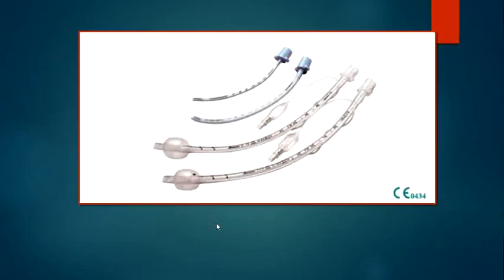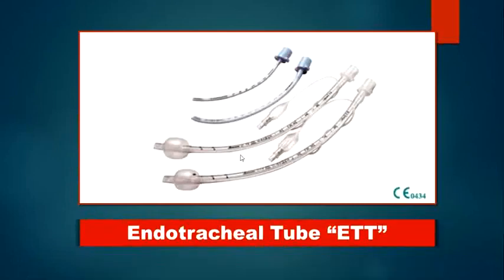Now we go to another instrument that is also commonly used in pediatric emergency situations or in the unit, but not commonly used in neonatal resuscitation. We say it's of a low percentage; very rarely we need to reach the level of endotracheal intubation. So this is the endotracheal tube. Can you see here, we have two types of endotracheal tube: the cuffed size, and the uncuffed size. We will know the difference between the two types.